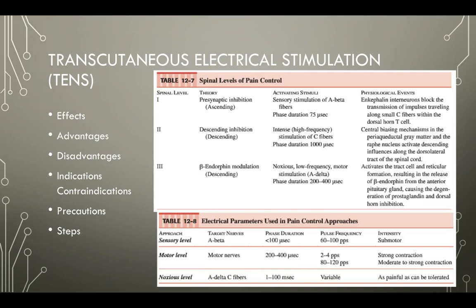And then level 3 is going to be the pins and needles, but then we need to get to a muscle contraction. And once we get to the muscle contraction, we can take them wherever they want to be. We can stay just at that muscle contraction level. We can get more intense if they want that, and we can keep moving it up too as they accommodate. But we want to continue to see that. Also want to assure them that we're not going to electrocute them, right? Especially if you're doing the underwater stim, you need to reassure that process more. You can offer to demonstrate on yourself.